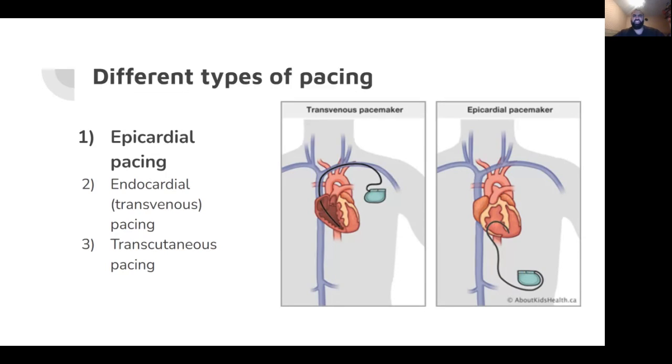And you do that if the patient in the acute setting had a heart rate of, let's say, 30 or 40, and it was compromising their blood pressure. And of course, as with all these things, this is something that you'd always do under senior guidance. You'd never do something like this really on your own as a junior doctor.